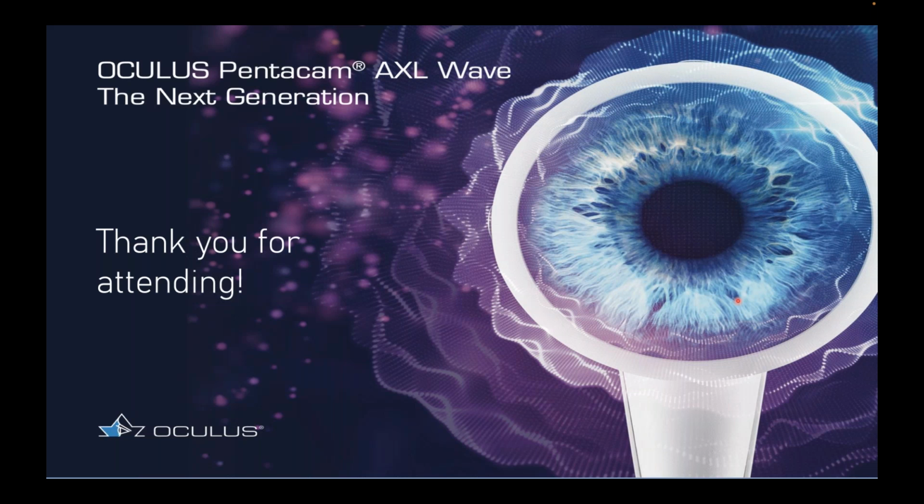So I think it's probably vital to just say, whatever instrument you have, get to know it really well and understand how it presents the data to you, more than a generic book that talks about everything. Reaching out to friends that use a similar instrument is also very helpful. Experience is the best teacher. I find that a lot of the printed things are often outdated or not always as accurate as they could be. So talking with people that use the device and have lots of experience is a great way, but the interpretation guide is also very good.